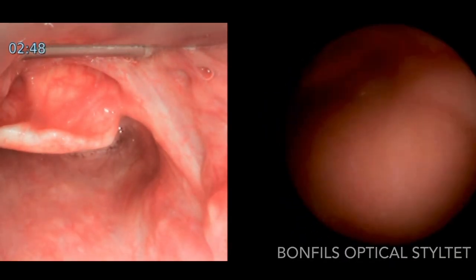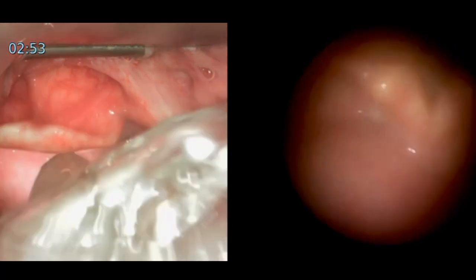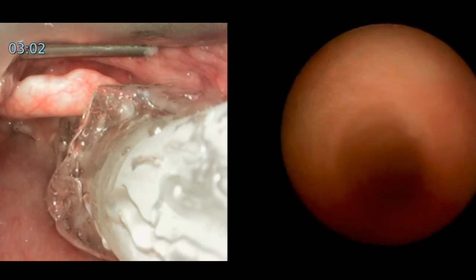Once in the ballpark and the tip is passing behind the epiglottis, we're shifting our view to the right-hand side of the screen, looking at the endoscopic view from the optical stylet, passing the tip of the tube just through the vocal cords. We can then see down the trachea, confirming the subglottic area is clear.